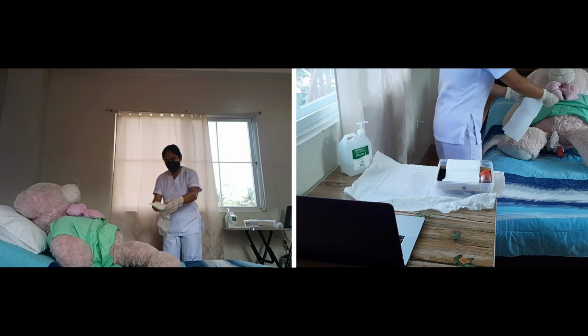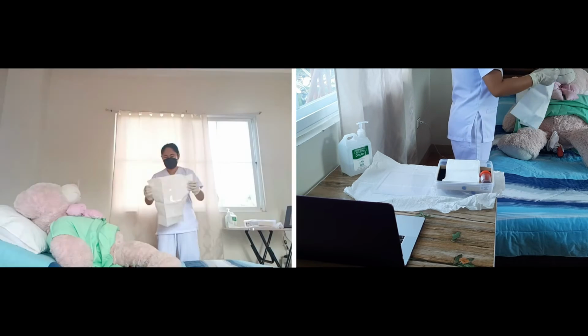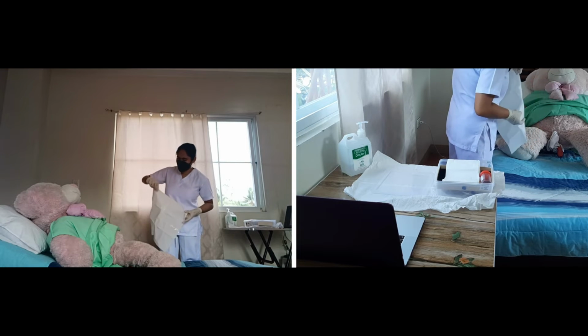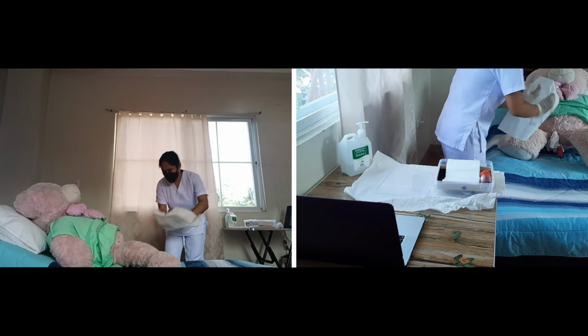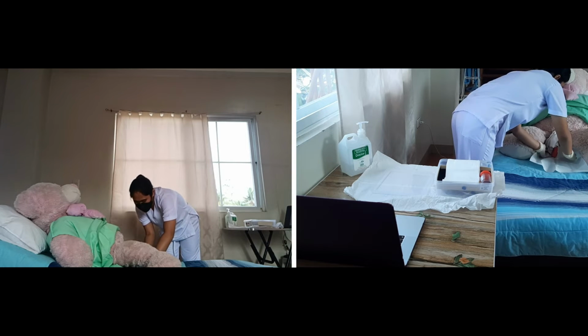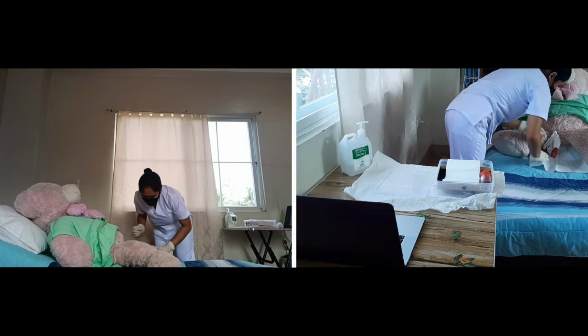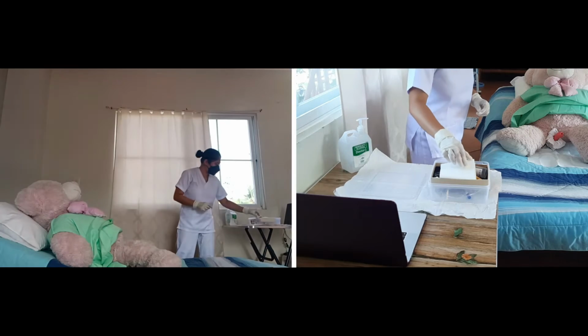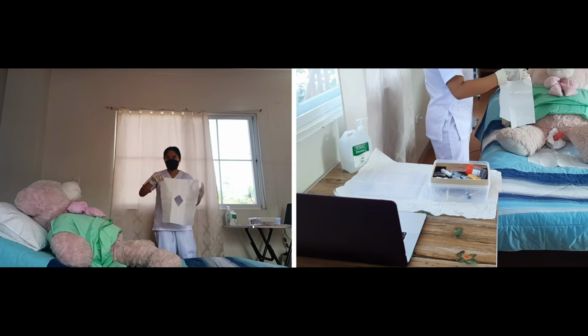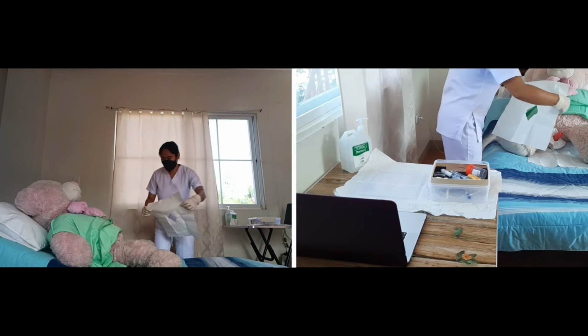I'm gonna be placing it here with the shiny side down. Okay, so Mr. Park, can you raise your hips for me? Okay, yes. Okay. We're gonna be using a fenestrated drape to provide privacy for our patient, which is placed over the perineum.